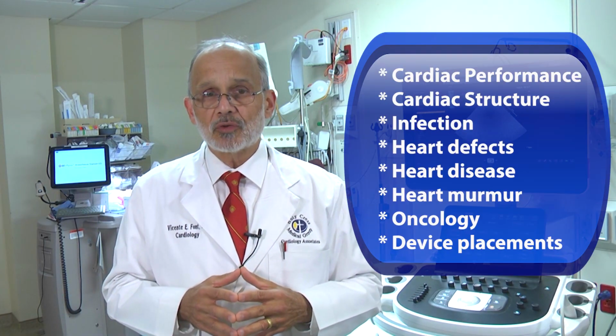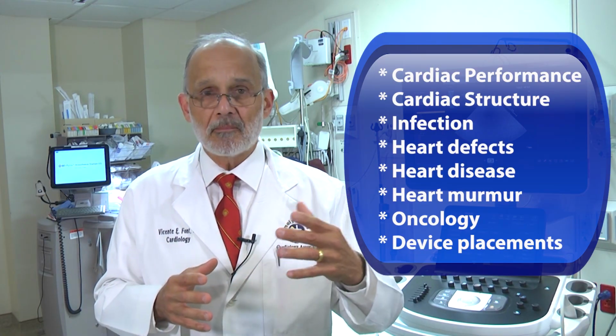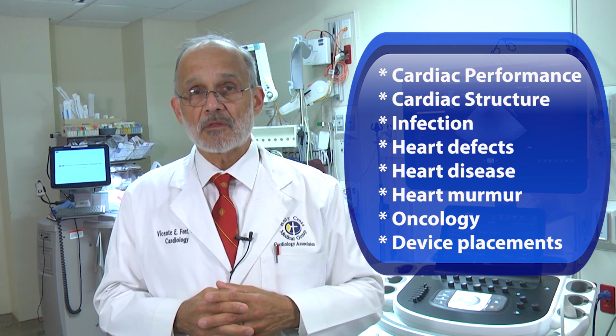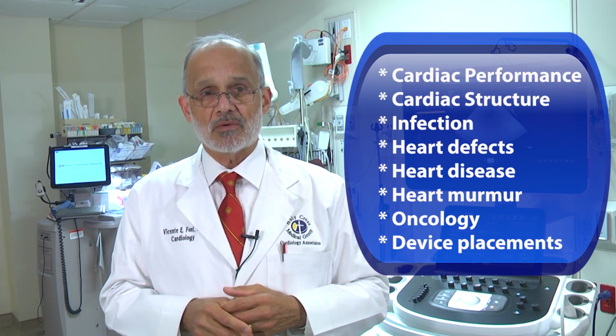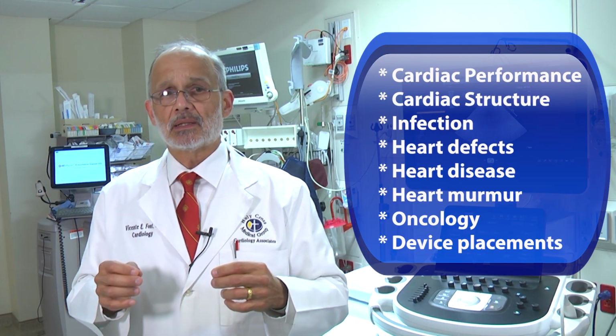It is also useful in the evaluation of heart infections, we call that vegetations, heart masses, tumors, congenital heart defects, diseases of the pericardium, which is the sac that covers the heart, evaluation of ischemic heart disease or coronary artery disease.